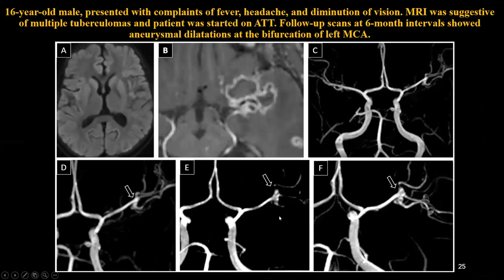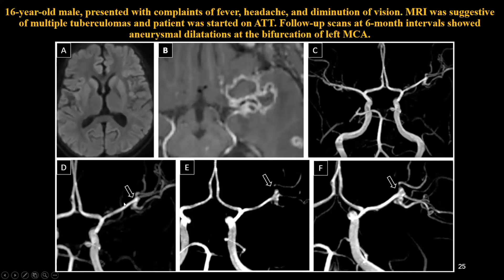Here is an interesting case still in our follow-up: a 16-year-old male with fever who had classical granulomas along the left Sylvian fissure. On the left MCA there is some irregularity with bulbosity at the left MCA bifurcation. The patient was started on ATT and followed at six months, one year, and one-and-a-half years. You can see how the dysplastic MCA bifurcation is turning into a complex aneurysm — this is aneurysm formation secondary to mycobacterial tuberculosis infection.